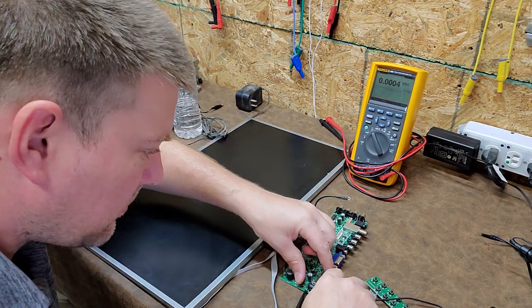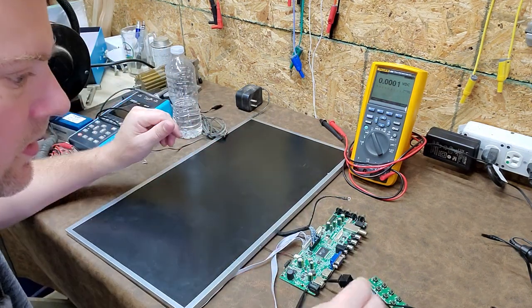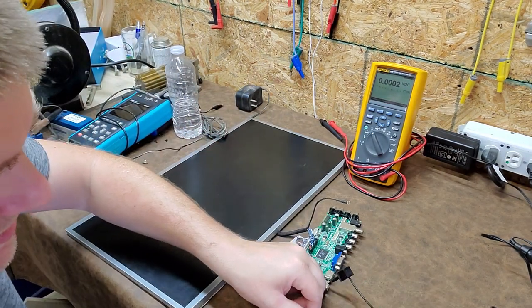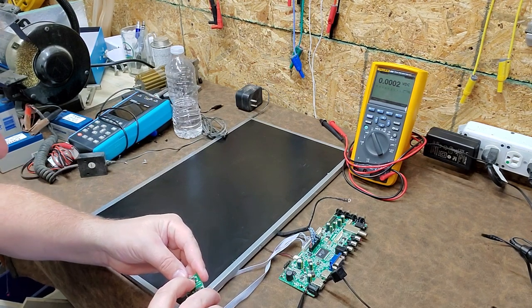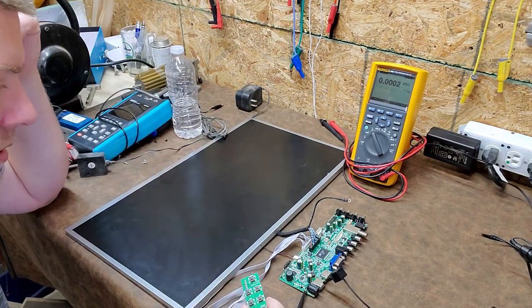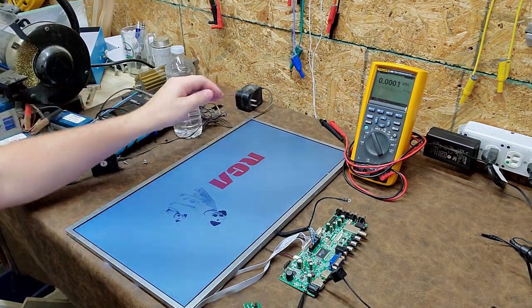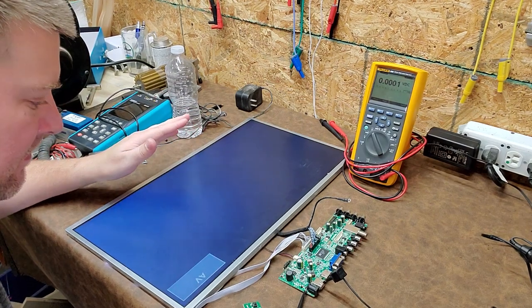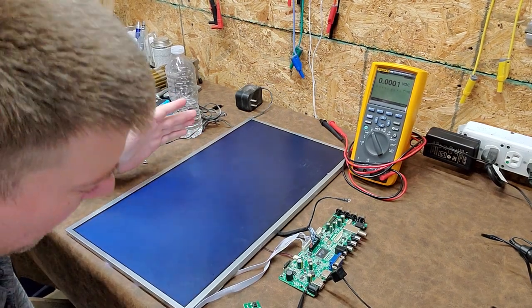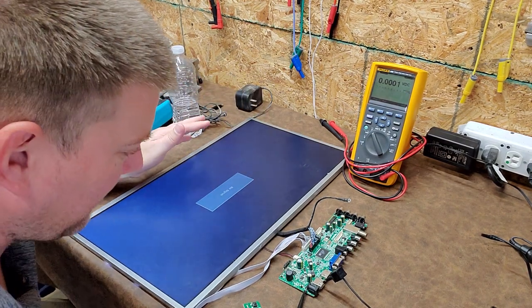Oop, wow, it's not really sticking on there, is it? There we go. All right, and let's go ahead and test it out. Hey, look at that. Oh, you guys, look at that. Okay, so I've got a clear picture. My backlight is working all the way around.